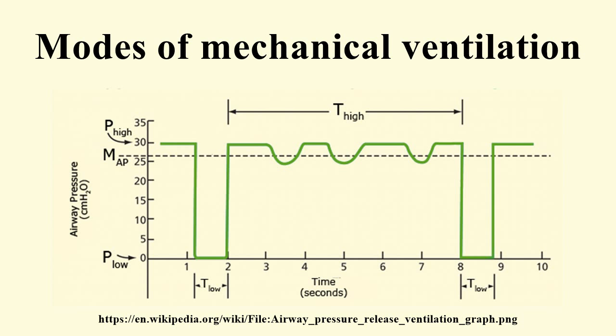The method for monitoring whether or not the patient is meeting the required minute ventilation differs by ventilator brand and model, but, in general, there is a window of monitored time, and a smaller window checked against the larger window to decide whether a mechanical breath is needed to maintain the minute ventilation. MMV is an optimal mode for weaning in neonatal and pediatric populations and has been shown to reduce long-term complications related to mechanical ventilation.